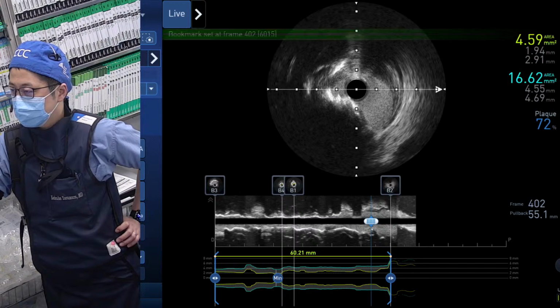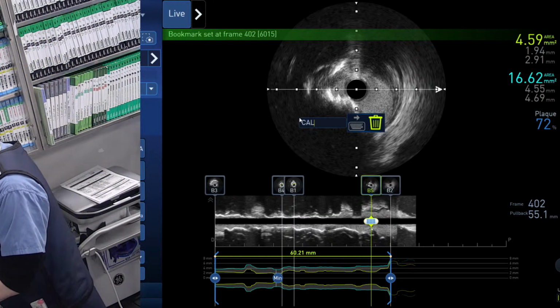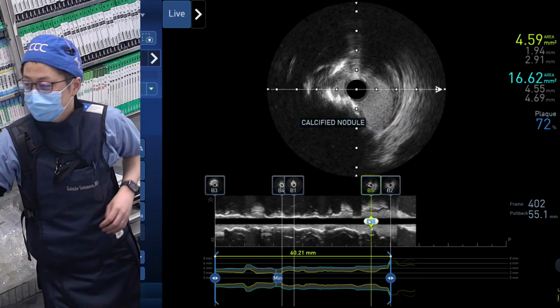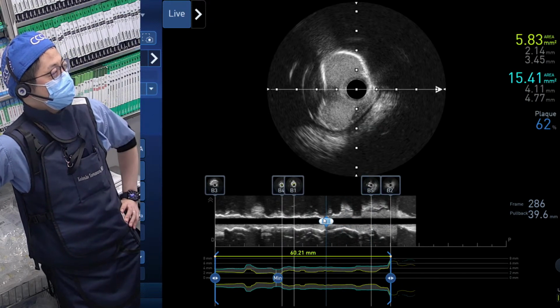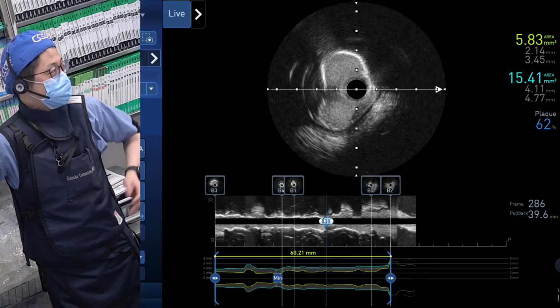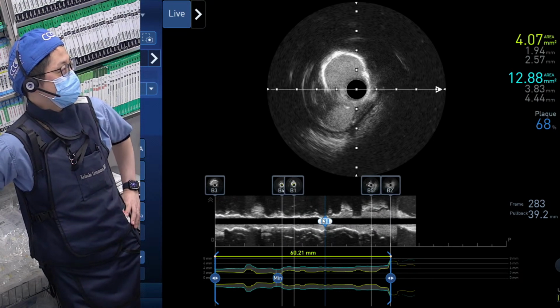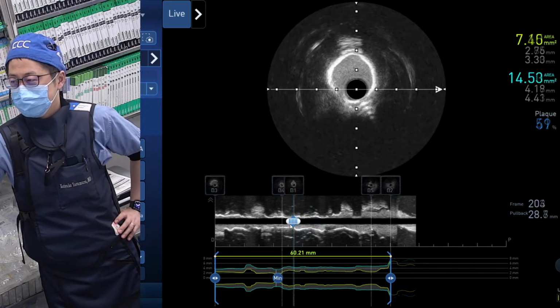Connect, this is what we are learning. That's why imaging is so crucial before you select the IVL balloon. Sounds good. What do you think, Kiski? Yeah, it's up to the doctor. If you want a 1-to-1 ratio, 3.5. But the tightest part is very tight, so 3.0. Since Rota did not do a lot in that proximal area, and if you need 1-to-1, then it has to be 3.5.